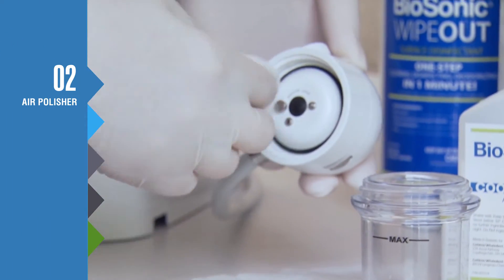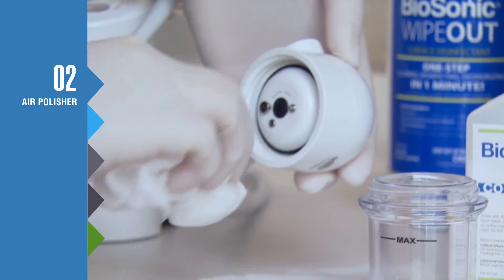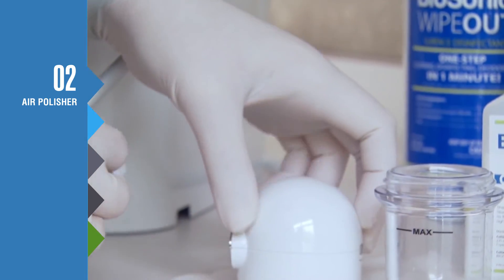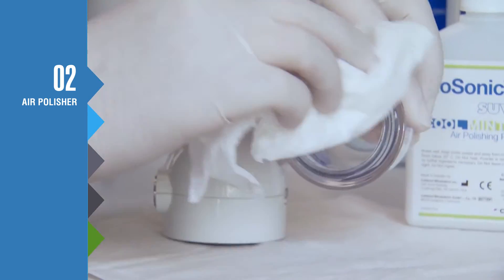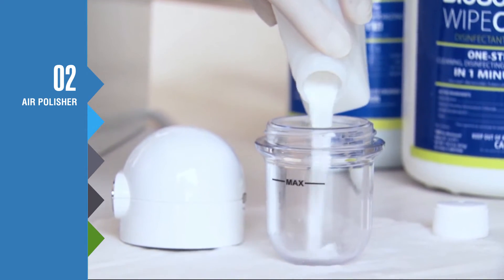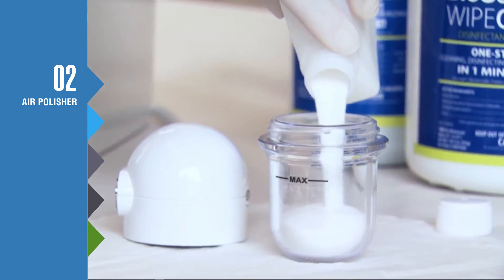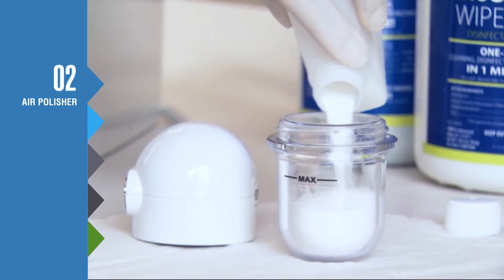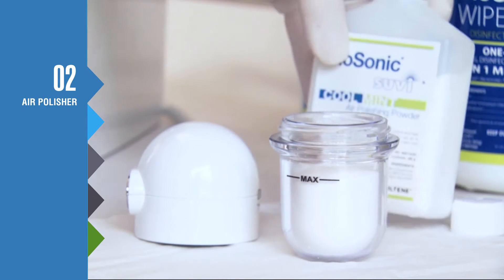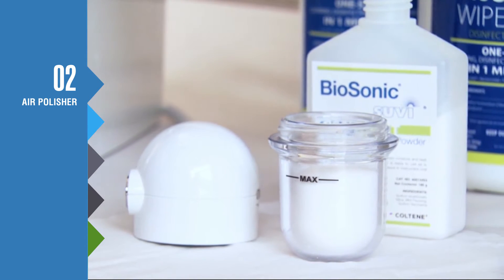To setup your air polisher, always make sure that the powder cap O-ring is clean and in position. Use a soft cloth to wipe off any powder left on the ring. Fill the powder container and tightly screw the container onto the cap. Make sure to always reseal your powder bottle after use, as it is important that no moisture is exposed to the powder.